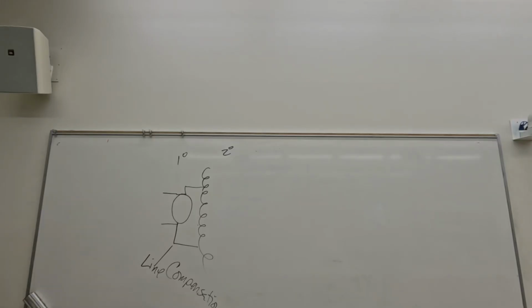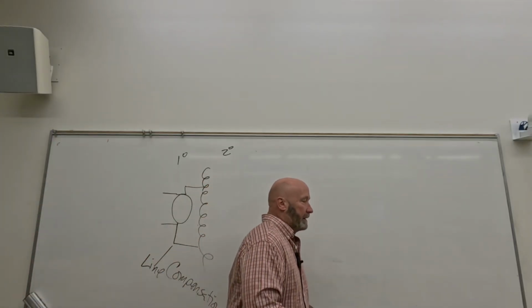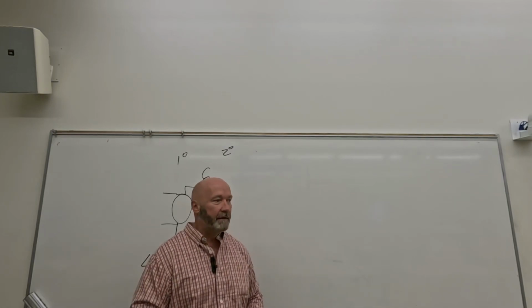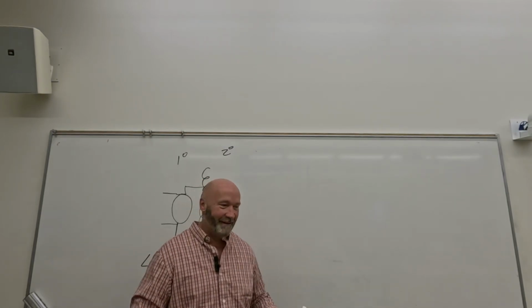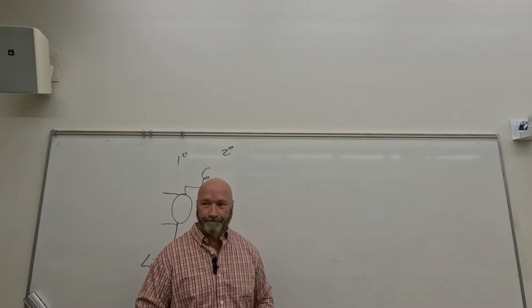So there are some differences and some similarities between RF rooms and radiography rooms. Okay, so unless you have a room that is specific for dedicated chest or something like that, then every room is going to have, the word that they use is couch.